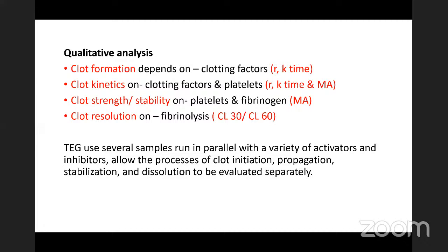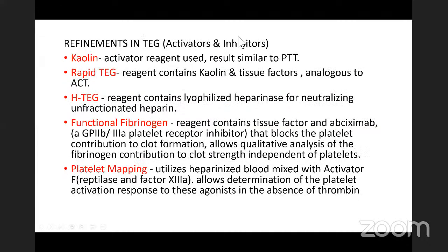CL30 and CL60. TEG uses several samples run in parallel with a variety of activators and inhibitors, which allows the processes of clot initiation, propagation, stabilization, and resolution to be evaluated separately. Refinements in TEG include activators and inhibitors.